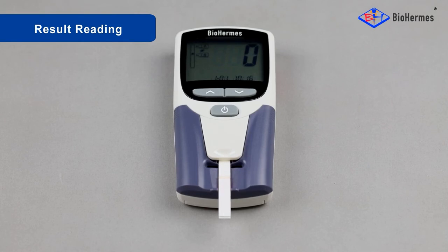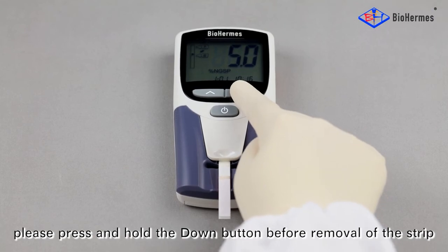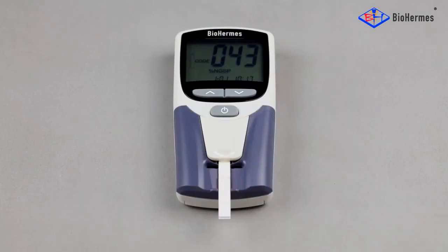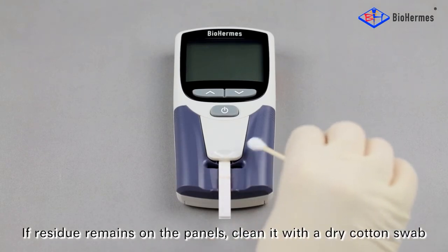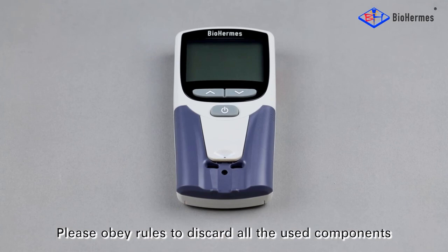Result reading: the result is displayed, for example 5.0%. Record the result when it is displayed. For an eAG result, press and hold the down button before removal of the strip. Press the OK button to start the next round of testing, or press it again to switch off the analyzer. If residue remains on the panels, clean it with a dry cotton swab. Remove the strip to finish the test, and discard all used components according to proper disposal rules.